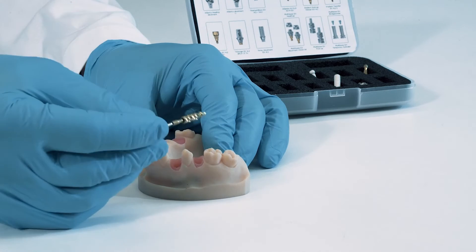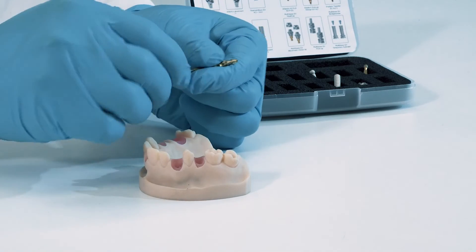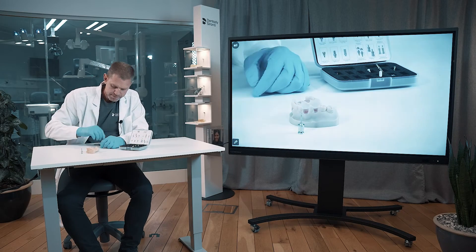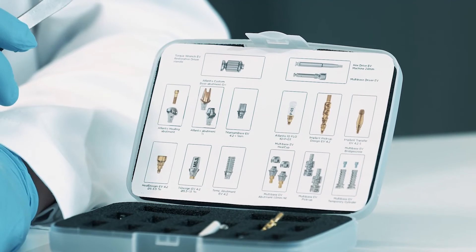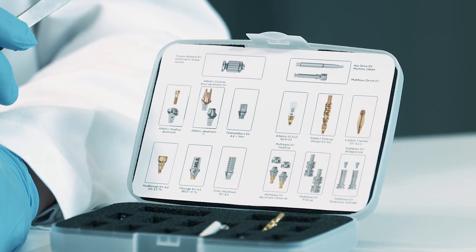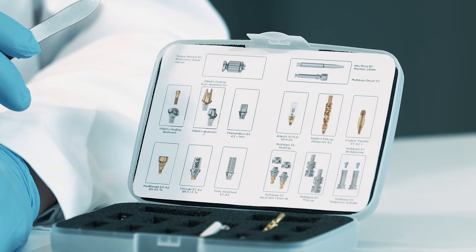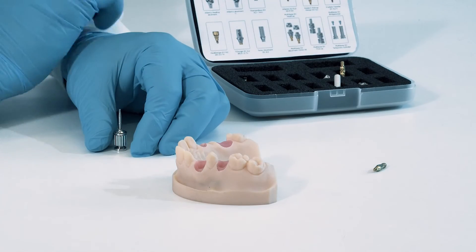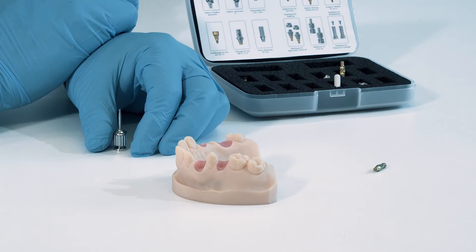The reverse procedure is to take it out and put it back. Finally, the implant transfer EV works with the same idea as the implant pickup, meaning it's self-guiding and goes down into the implant in a self-guiding sequence.